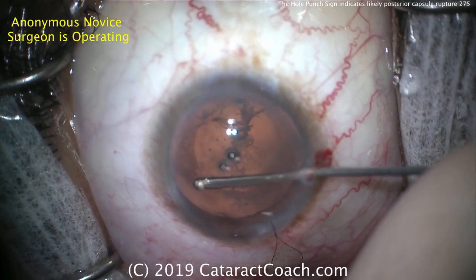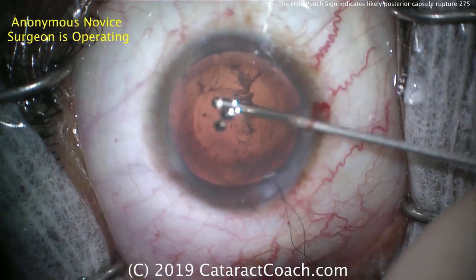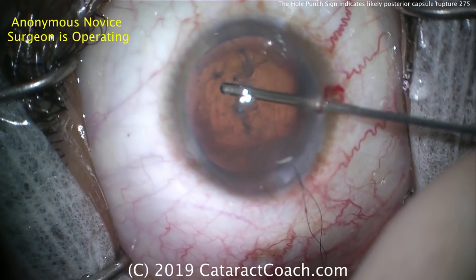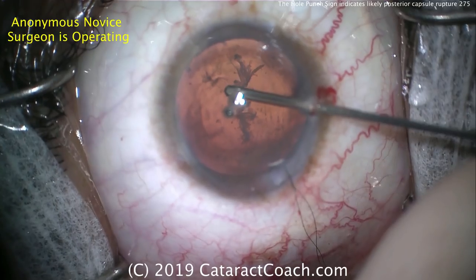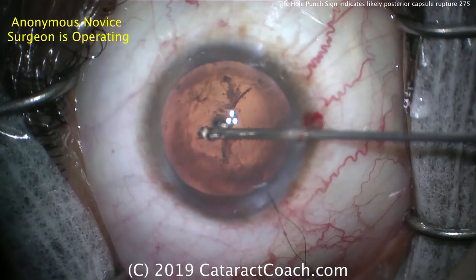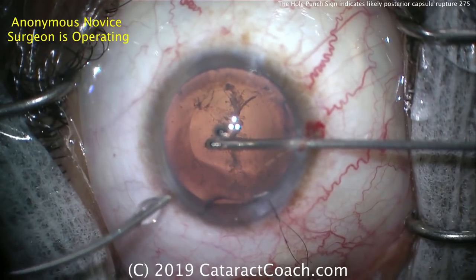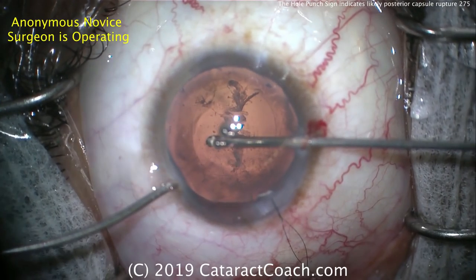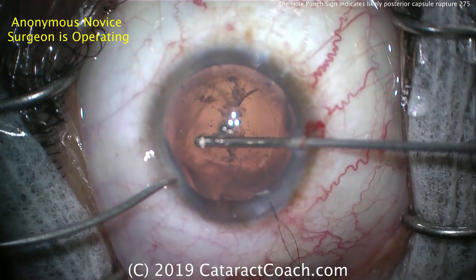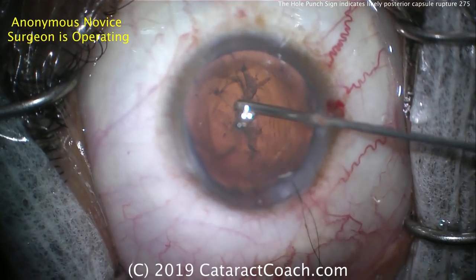Be very careful as you remove any lens material and do any anterior vitrectomy — careful not to damage the remaining anterior capsular rim. We need that capsular rim to help support our sulcus IOL. So cleaning this up, removing all of this material — it just takes a little bit of time. The surgeon now has infusion in the left hand and the vitrectomy cutter in the right hand.